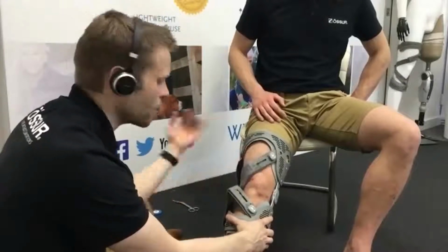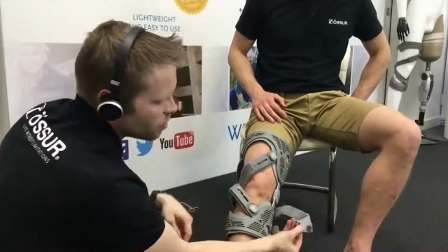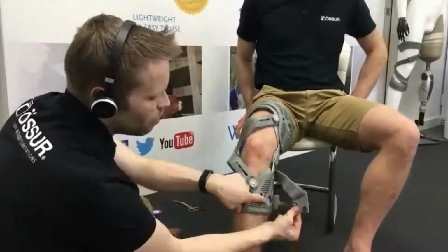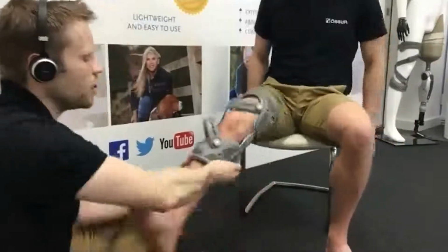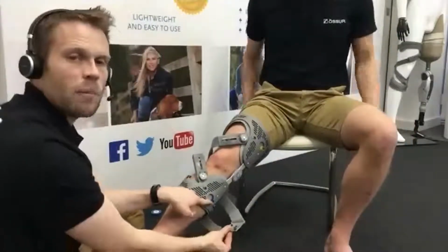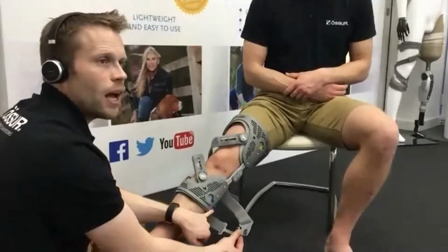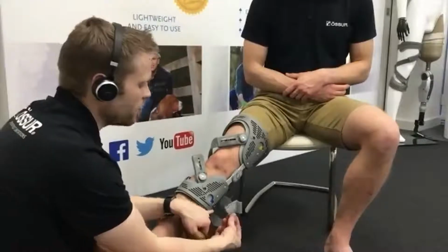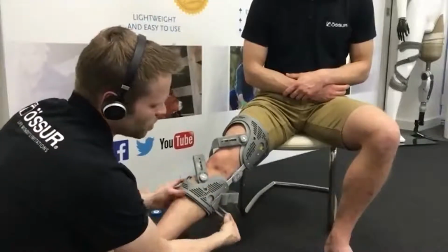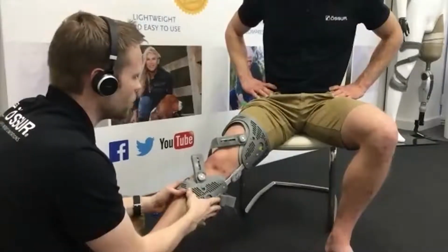Okay, we're bringing the strap round either side, and you can see that we're fastening this blue on blue here. So if we just straighten your leg again, Pete, we're going to need to go a little bit more laterally, and you can see that there's a blue marker here, like that. There's also a little shelf here, so it's really important that we've got that in the correct position, and it's sat like that onto that strap section.